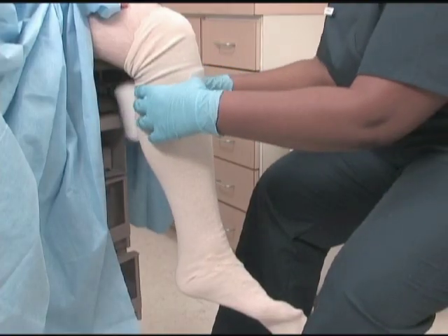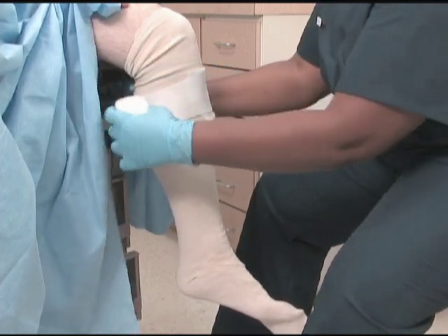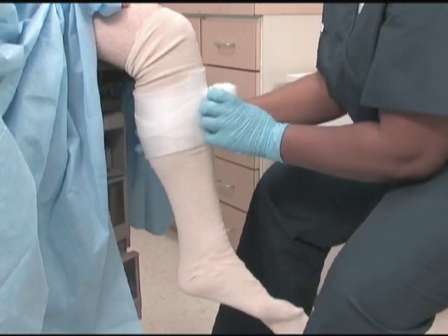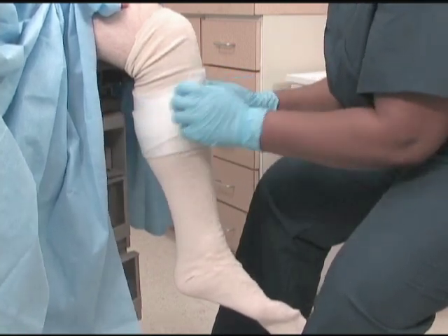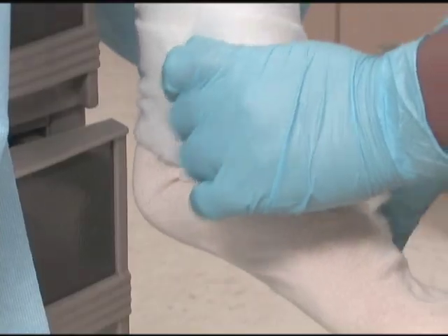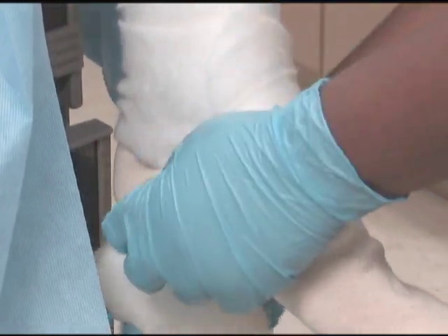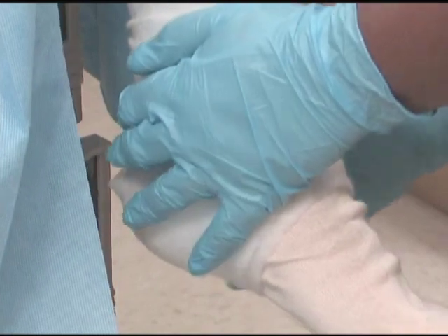Use a spiral bandage turn to pad the casting. Apply extra padding to any bony areas.